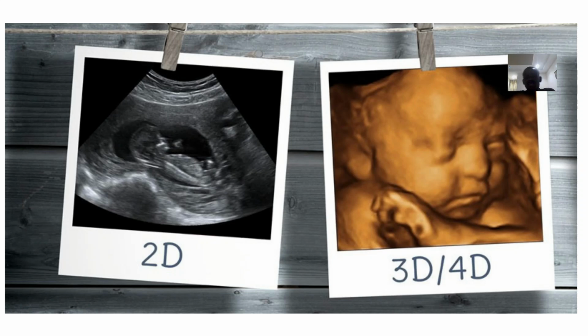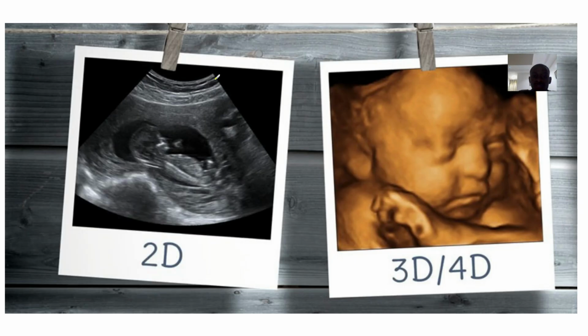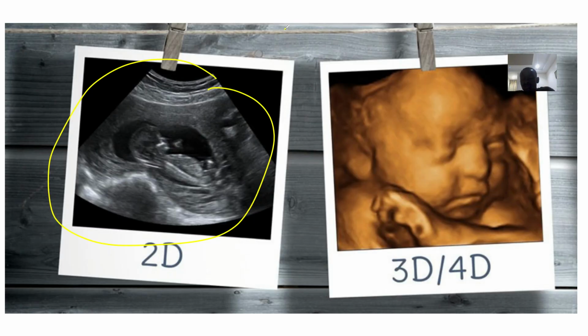In 2D is what most of our hospitals have. They have something like a triangle, but with 3D you can actually view the baby, so it's a better way. The 3D sonography, or you can say three-dimensional ultrasound, is an advanced imaging technique. A 2D image, before you can interpret it, you must be a professional. 3D converts it to something much more understandable.